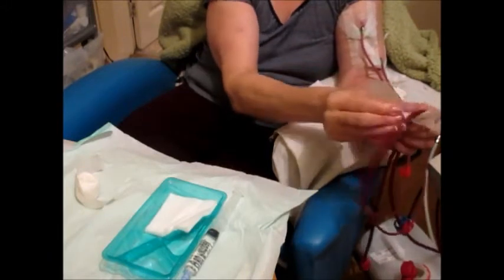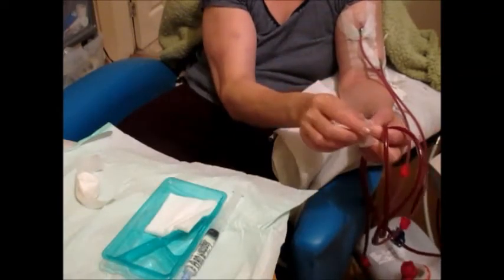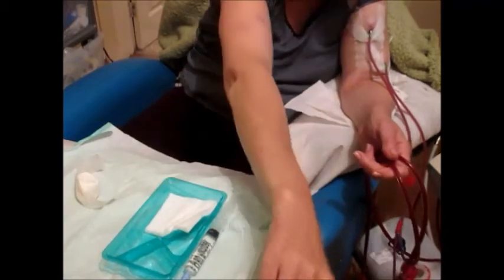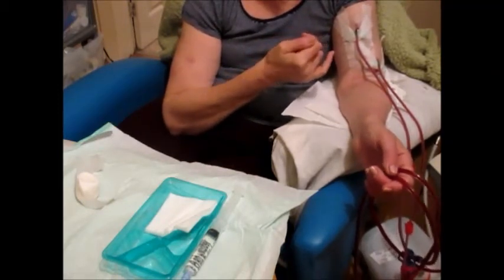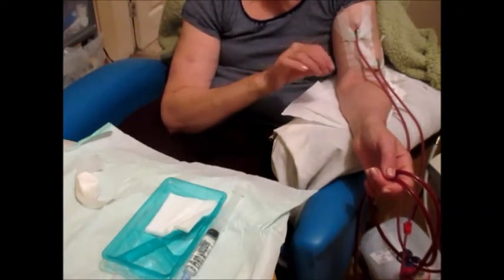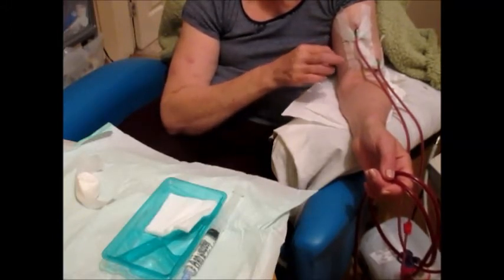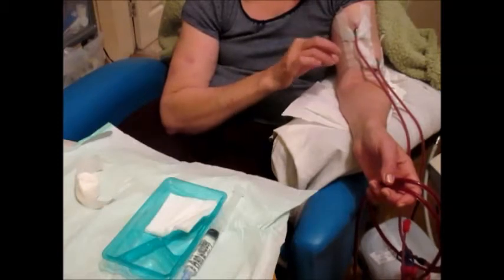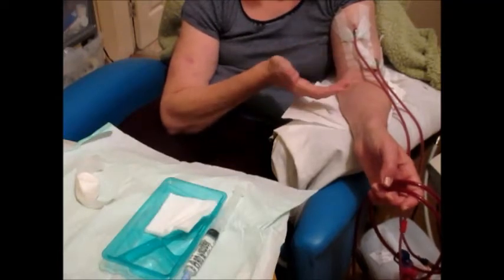Some home dialysis patients use something called a buttonhole technique, which means that little channels have been created in the AVF with a sharp needle, which remain in place for the patient to insert blunt needles at each treatment. It just makes it a bit easier for those who can't tolerate sharp needles and also for those who find it difficult to needle as well.